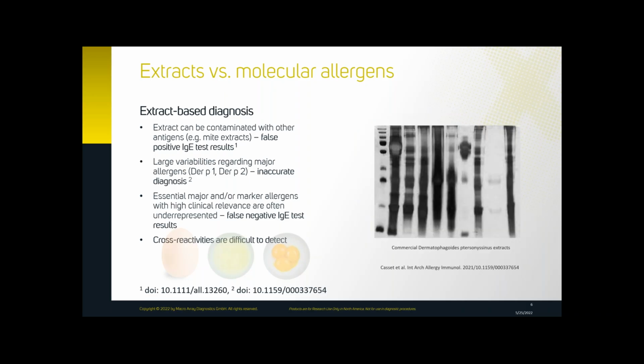I would also like to show you a picture of commercial allergens. Here, a picture of commercial house dust mite allergens that can be bought from different companies, and they vary greatly in their allergen composition. As you can see, they all look completely different.